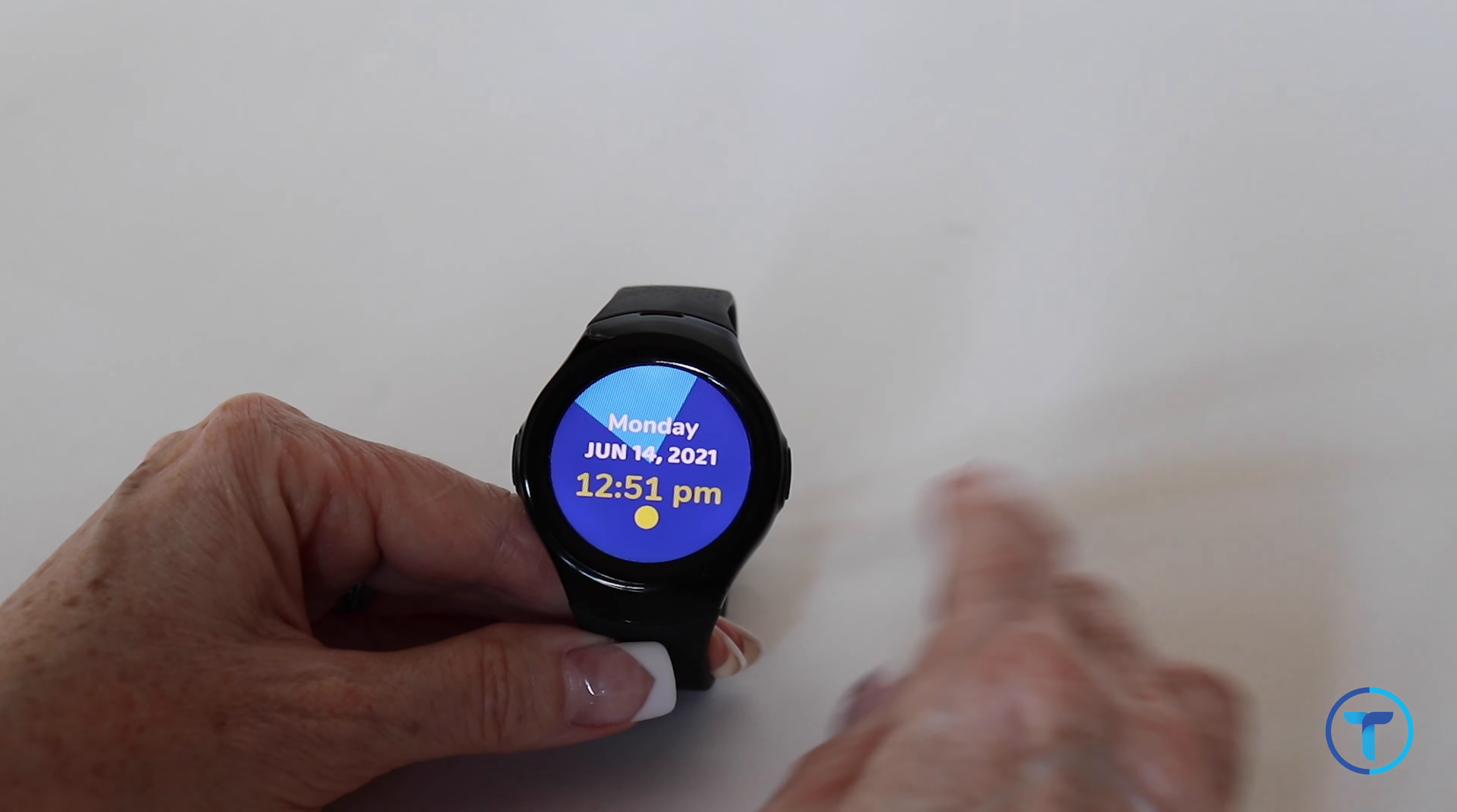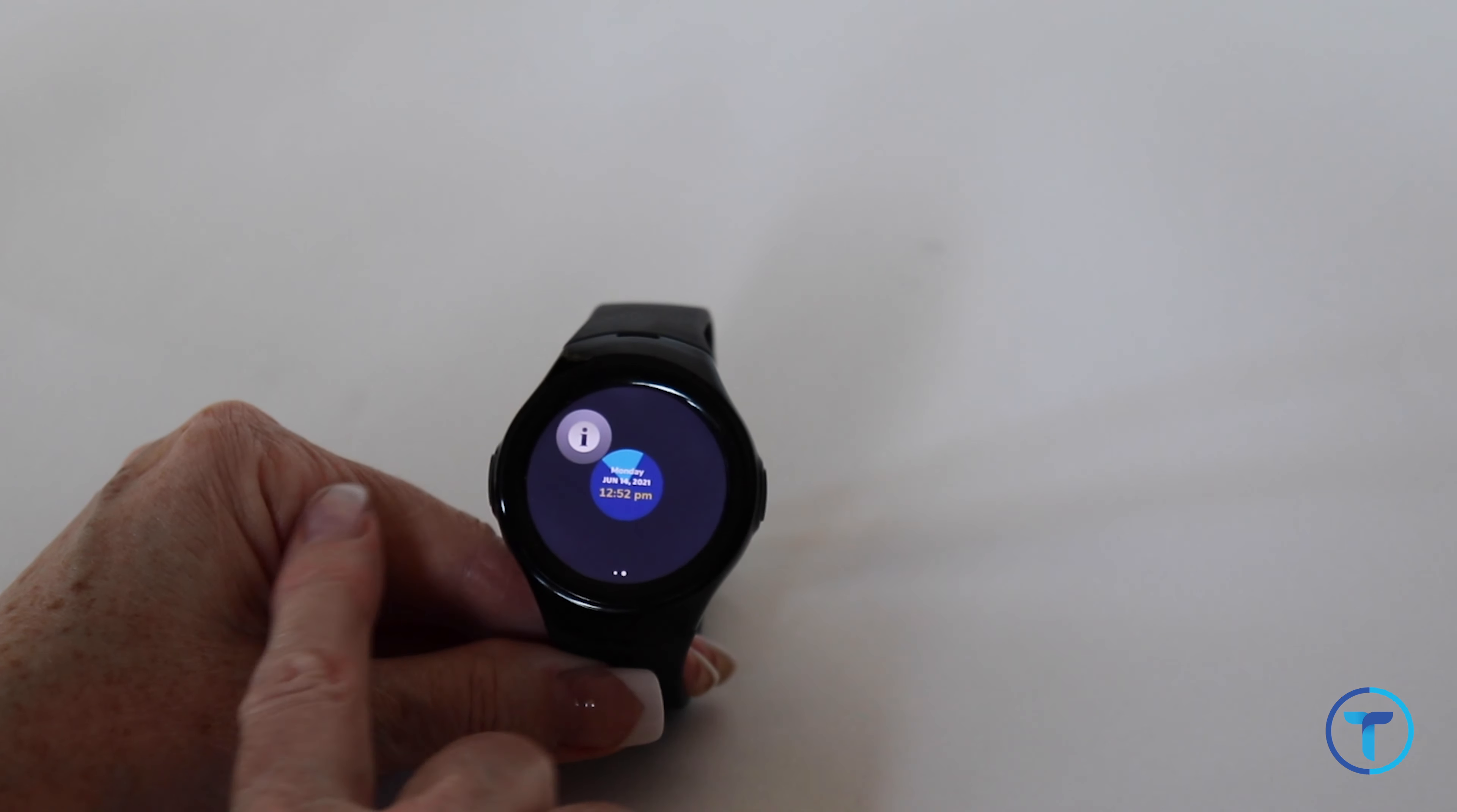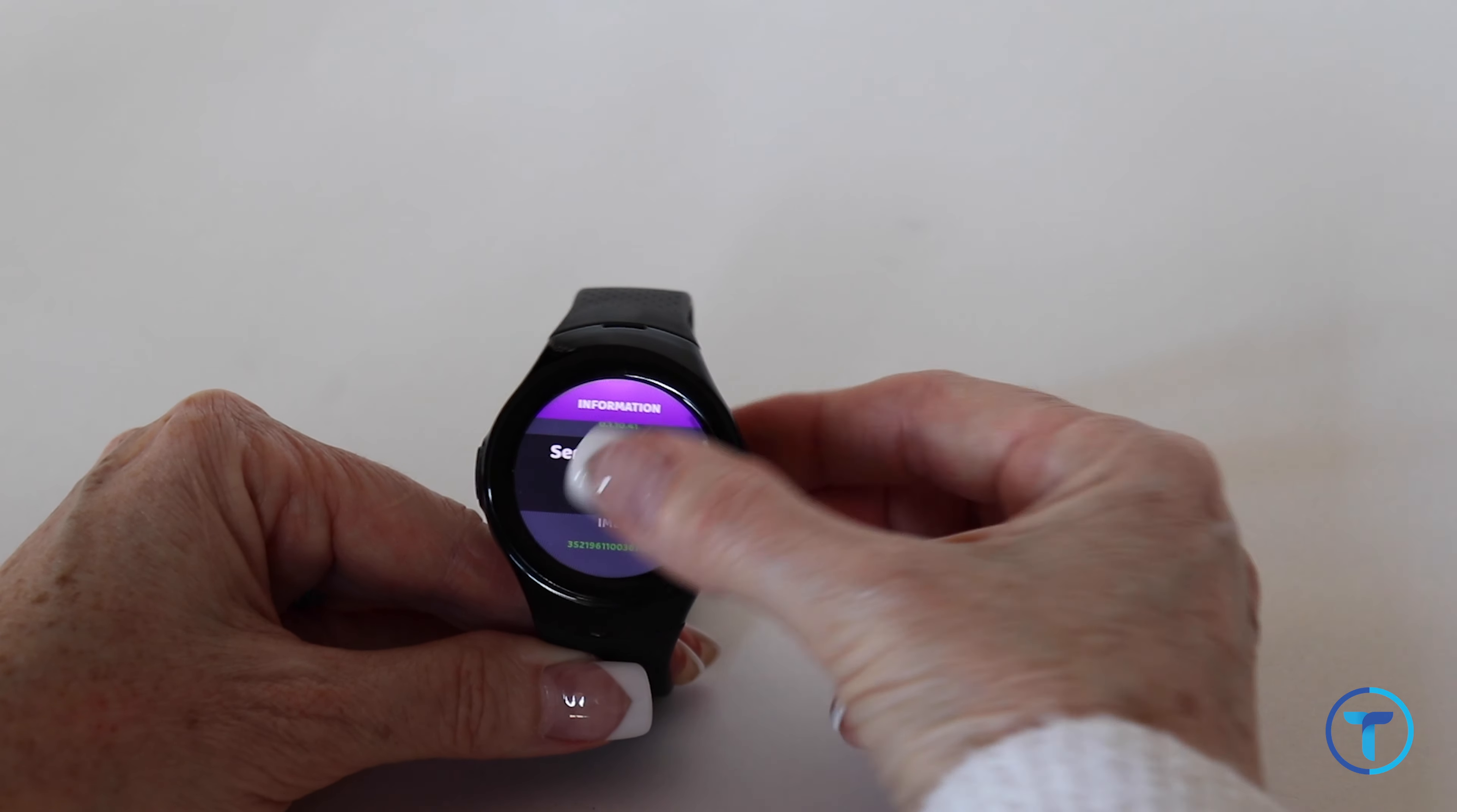To start, tap the center of the watch face and swipe right to left. Tap the eye icon and scroll down all the way to the bottom to User Settings.